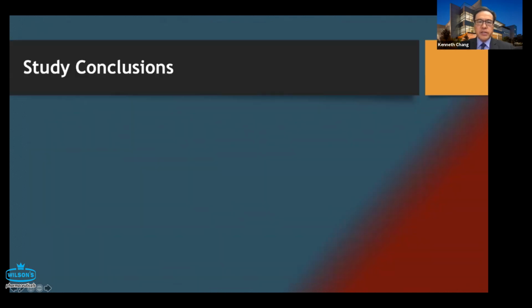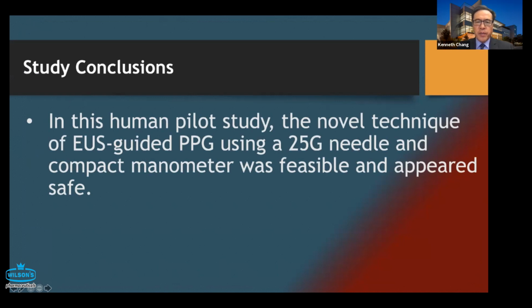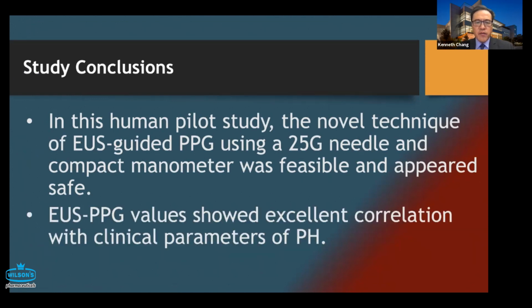So the study conclusion showed that in this human pilot, the novel technique using a 25 gauge needle and a compact manometer was feasible and appeared safe, although you cannot overclaim safety with 28 patients. The values showed excellent correlation with clinical parameters of portal hypertension.